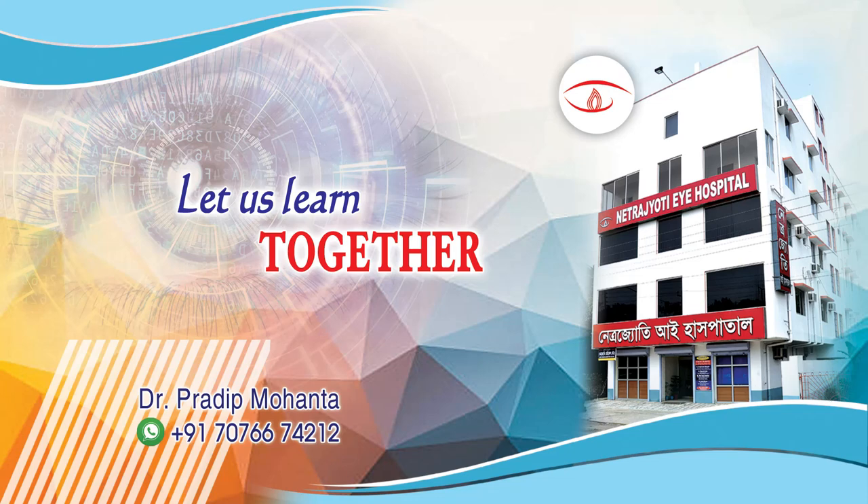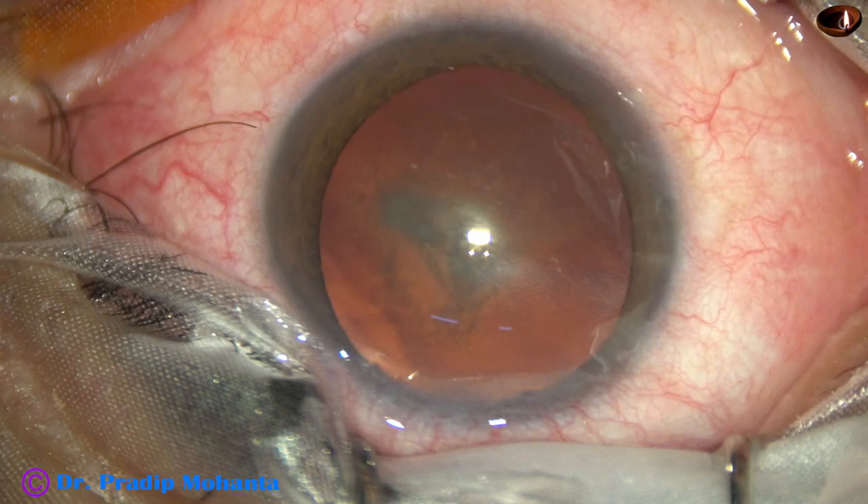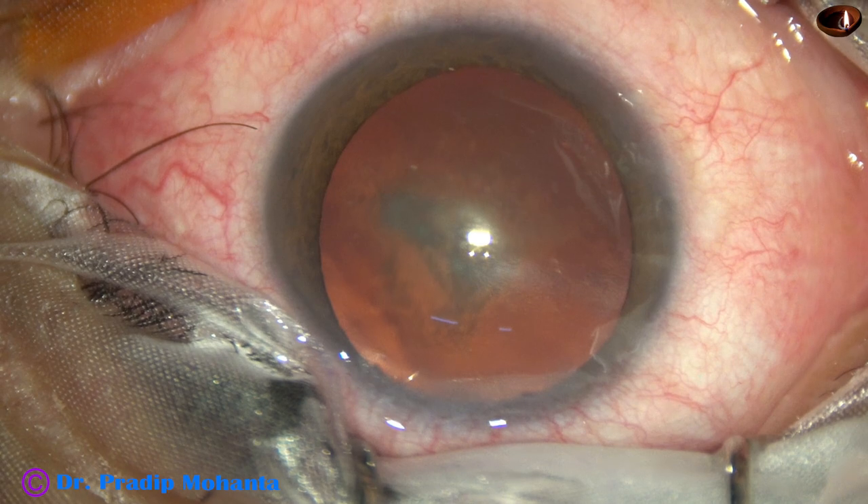Dear colleagues, welcome to my workplace at Ranaghat, West Bengal, India. Let us observe phacoemulsification of this posterior subcapsular cataract.